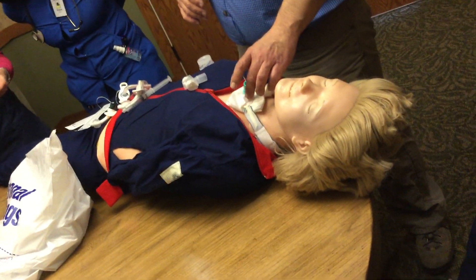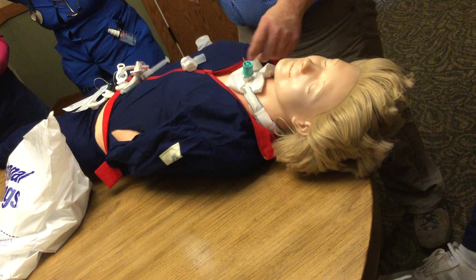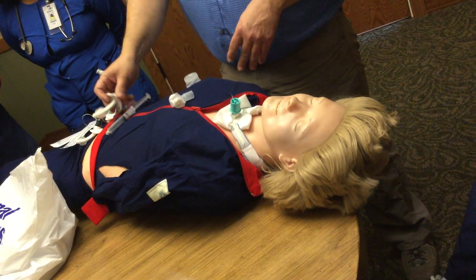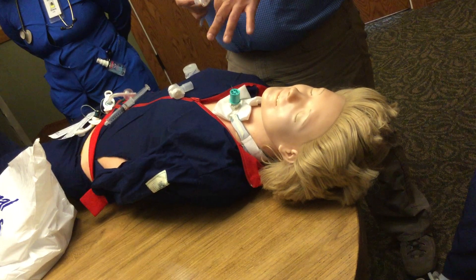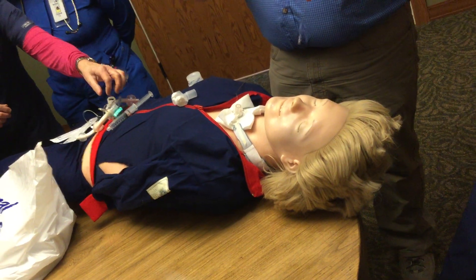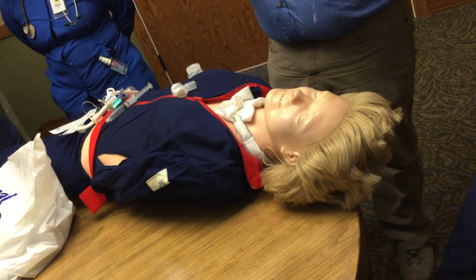This tube right here, he's got the speaking valve on, and the cuff has to be deflated. The reason the cuff is deflated, which a lot of you probably know, is if you put a speaking valve on, it's basically a one-way valve. They call it a Passy-Muir valve or a speaking valve.